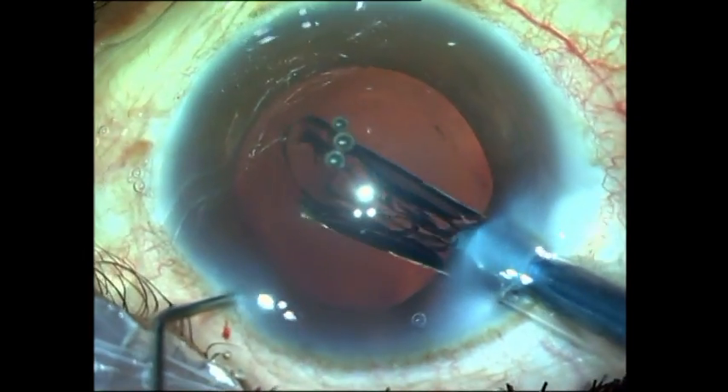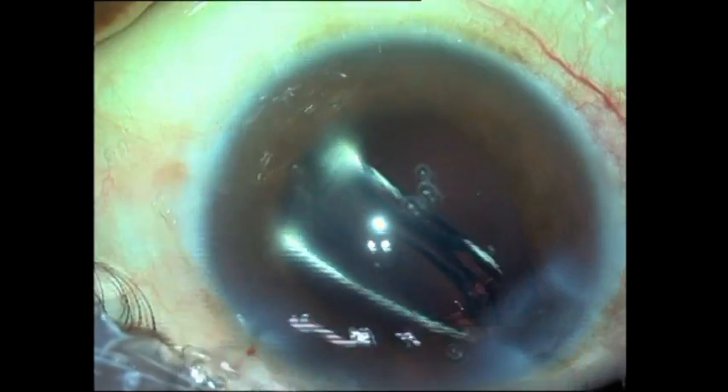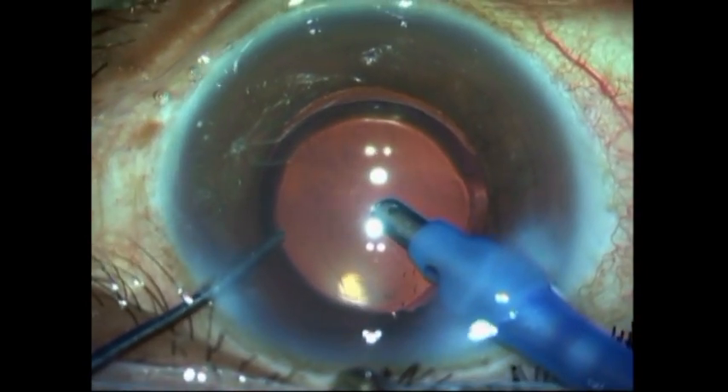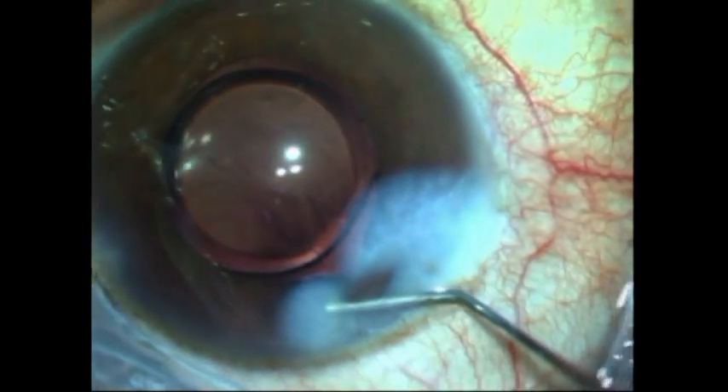While injecting the intraocular lens, you should take care that the leading edge of the IOL does not hit the central posterior polar area and that it slides gently into the fornices of the capsular bag.